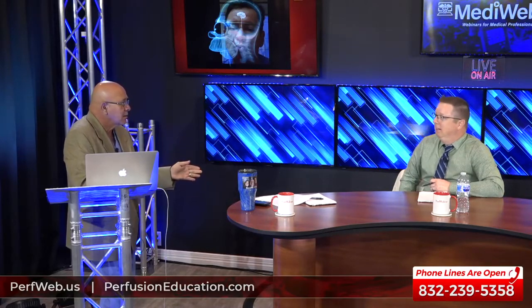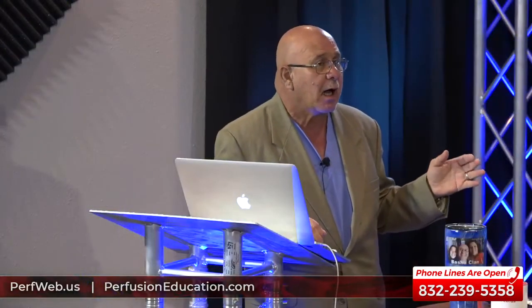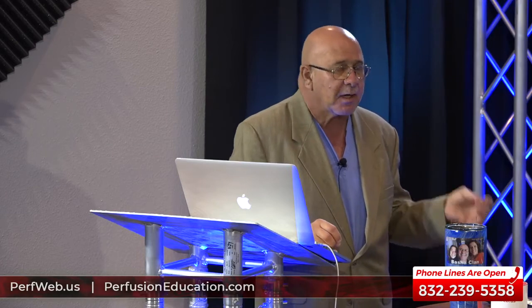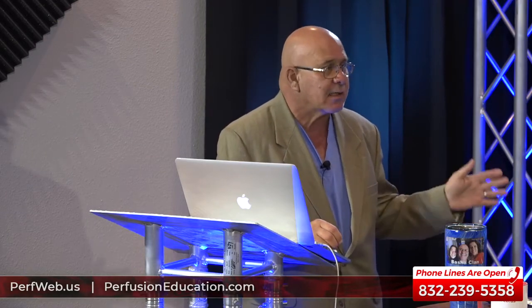I've had the pump clot off on me twice. You only have to have it happen once, but to have it happen twice in a career, and I've been doing this a long time, you don't want that experience. One was because protamine was given without telling anyone it was being given. That was a bad day, and we had to go back on pump. So that was that disaster.